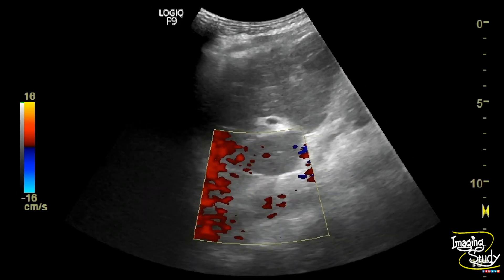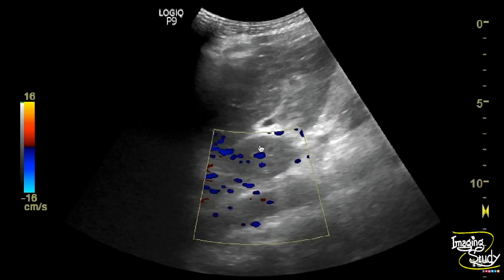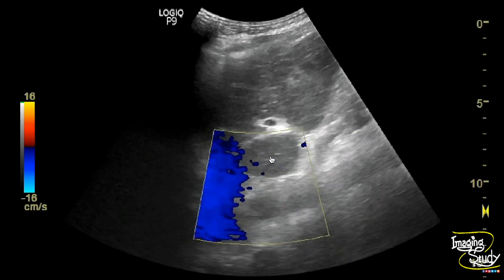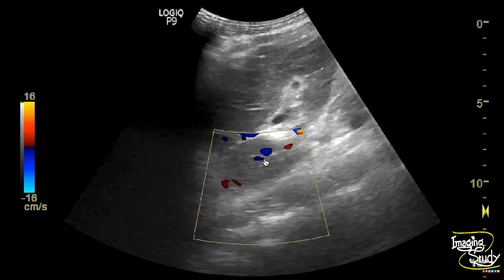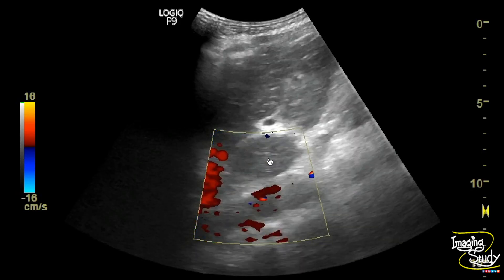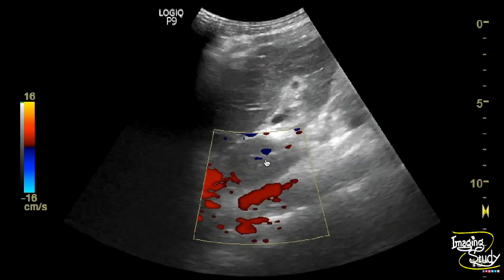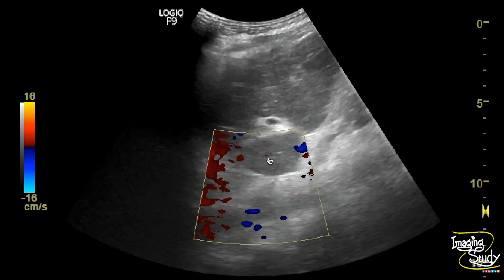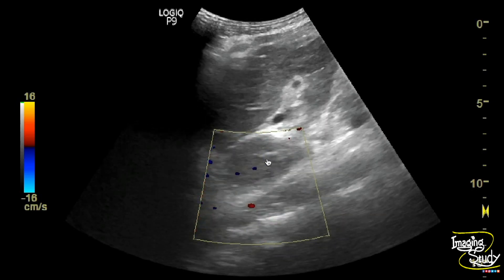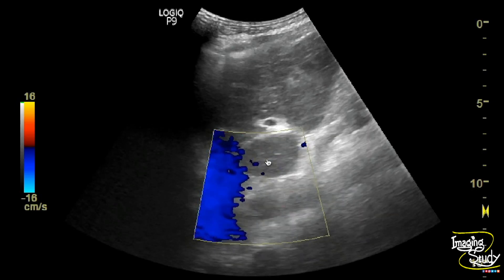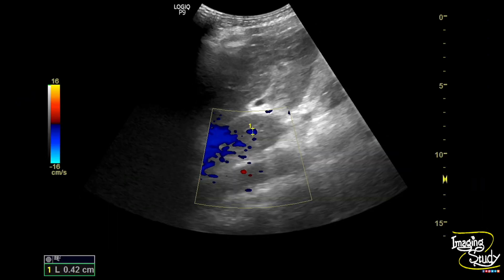Now here we are looking at the caudate lobe and you can see a small vessel at the mid part of the caudate lobe indicating a dilated caudate vein. The normal caudate vein diameter is up to 2 mm. Here we have measured the caudate vein and its diameter was around 4 mm, confirming it as a dilated caudate vein.